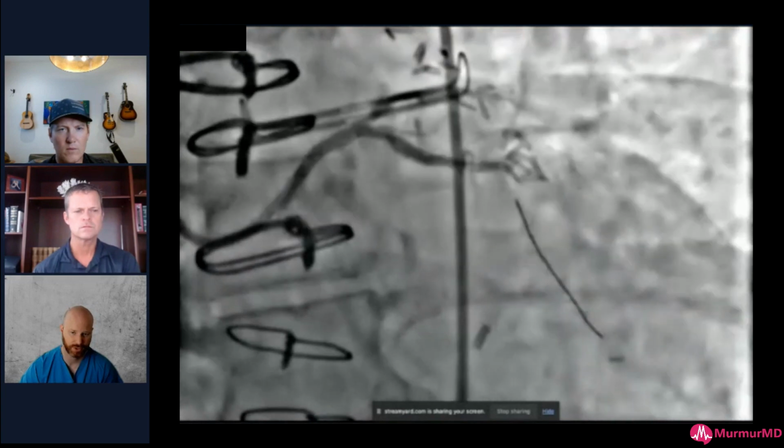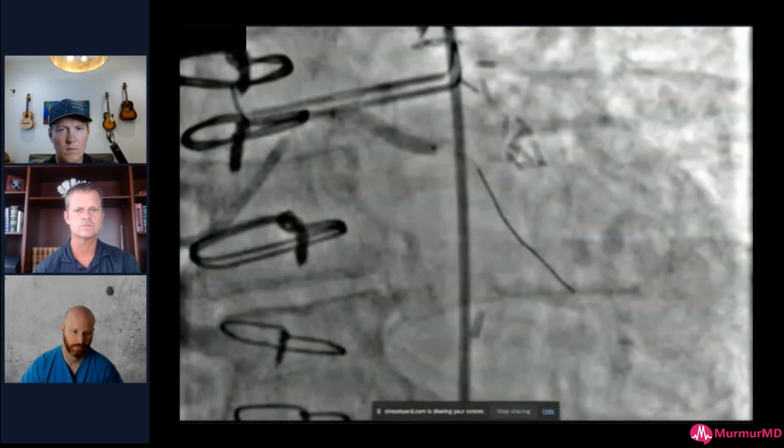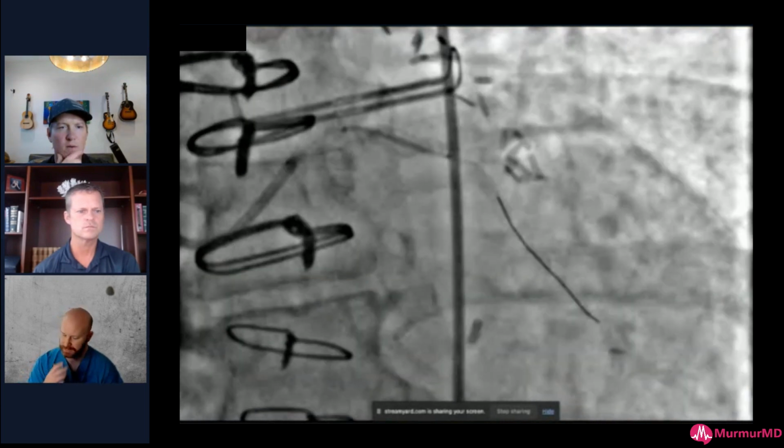But the more shocks you have, the better it is, because you're just not getting all the focused energy onto it. Chris, do you try to focus the emitter on the nodule when you're doing these? I mean, I try and move it 1 millimeter at a time.